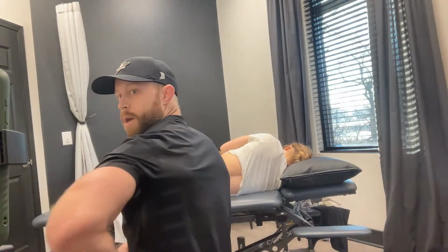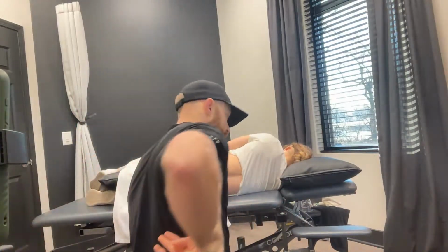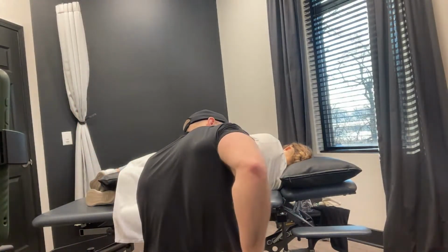From an identifying standpoint, you want to start with that body chart. If you've been to cervical and lumbar management, you know we always start out with quantifying where the symptoms are on this person's body. When someone's in an acute back spasm, it'll be a little complicated to find the exact spot of symptoms. They don't usually point to one thing. They often talk about that whole erector side. They might even point to that whole area of their low back and say it just feels locked up.